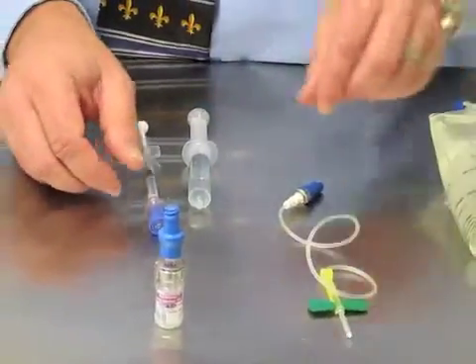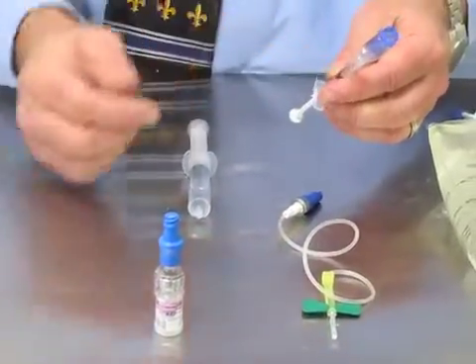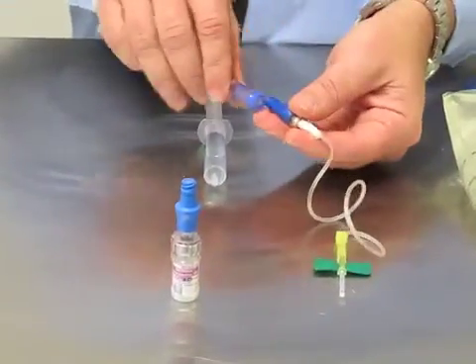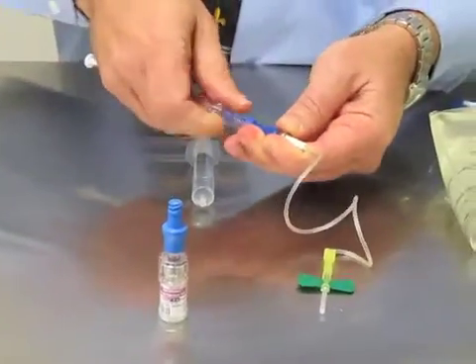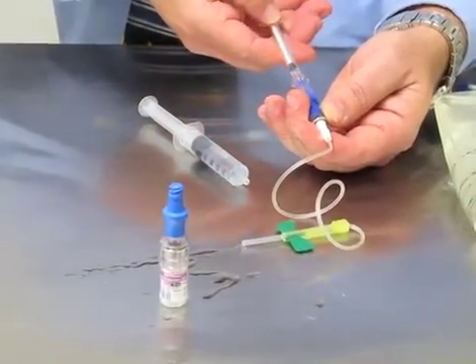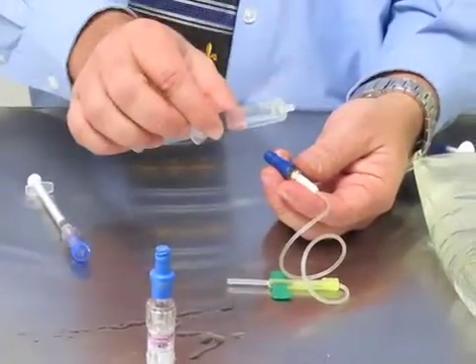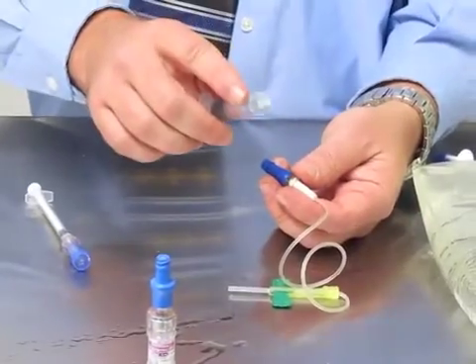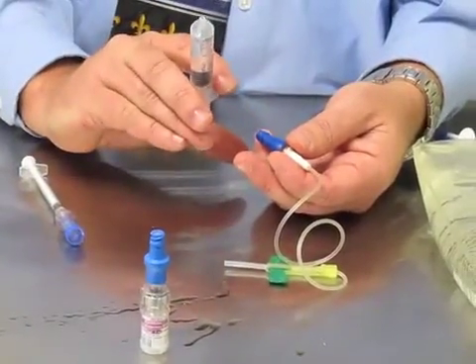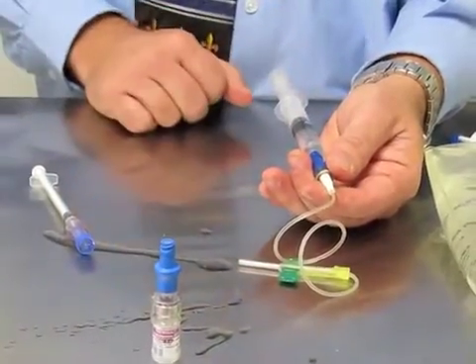Once my winged set is primed, I'm going to take my dose of vincristine — which for this demonstration is saline — with the closed system attached. I'm going to lure it to my microclave, give my drug, and then when I disconnect, I can access this with the saline flush. Unlike competitive products, it does not have to have a safety device. I just lure slip on and flush the winged set.